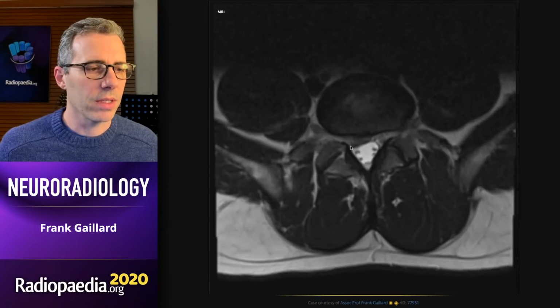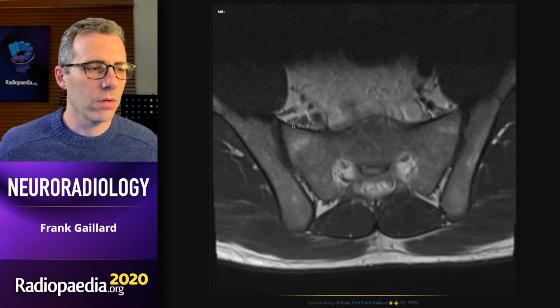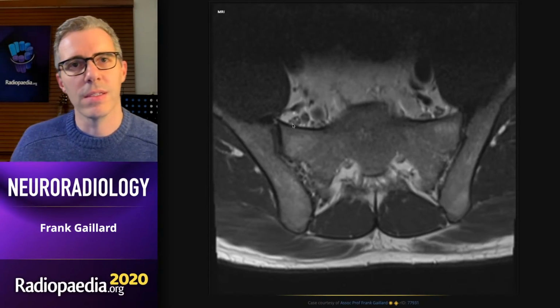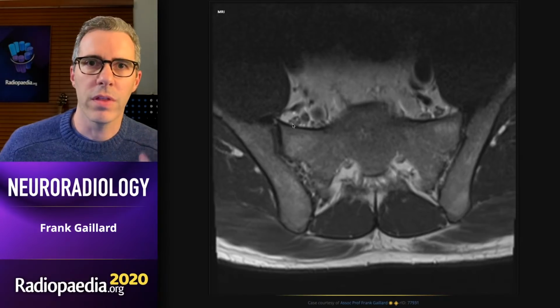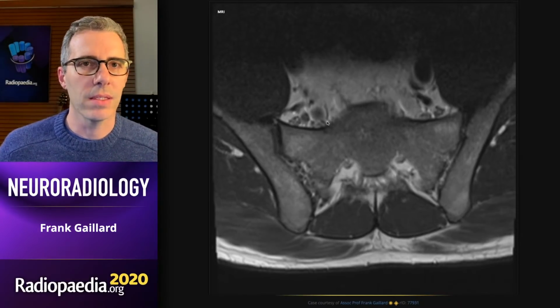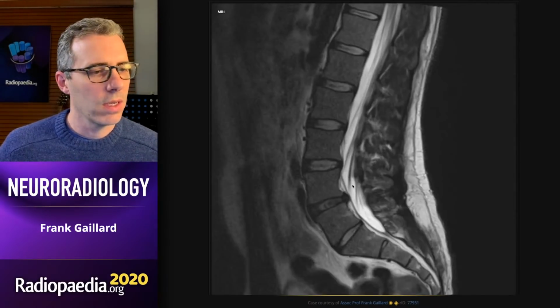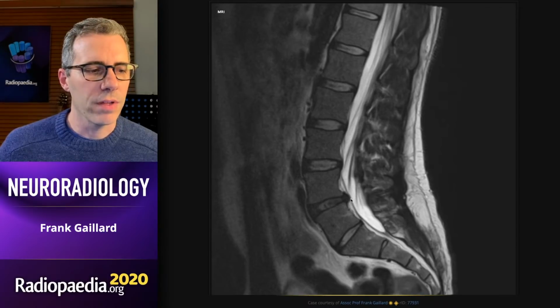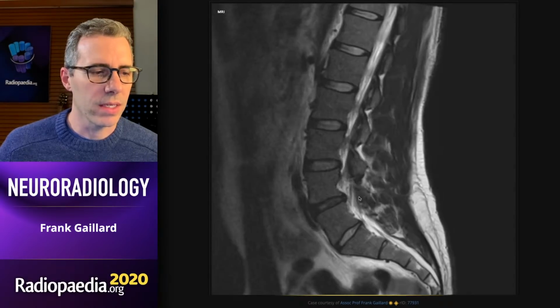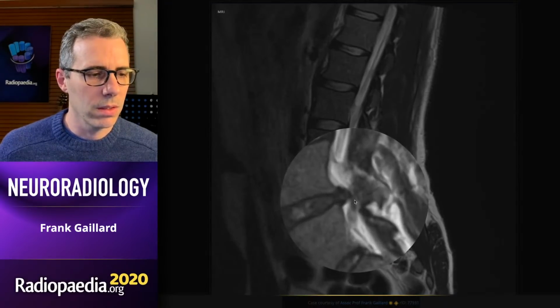Check, and there it is there. So down, so S1, L5. So in this instance, we have at least 4 things just in the lumbar spine pointing to the fact that this is a lumbarized S1 and that therefore L5 is coming through this subarticular recess and being impinged upon right there.